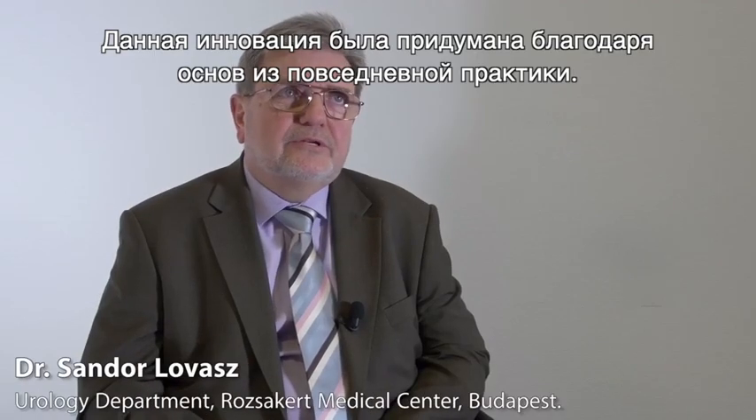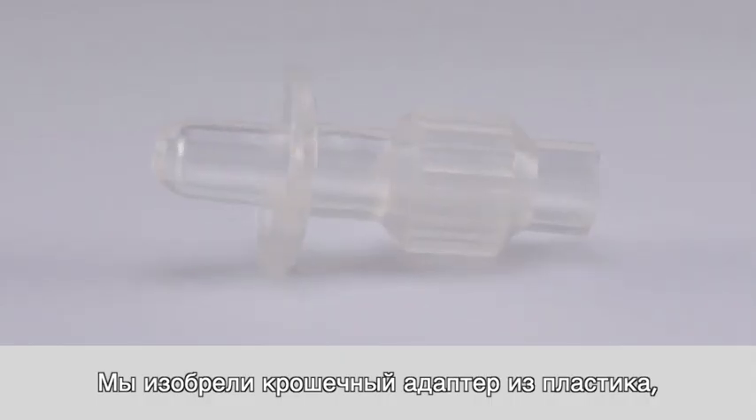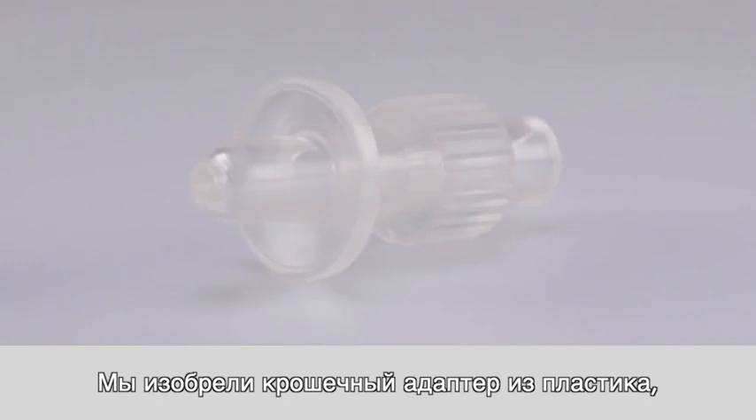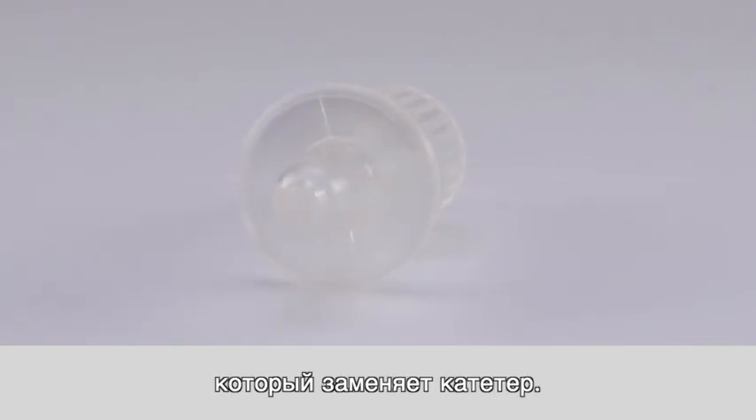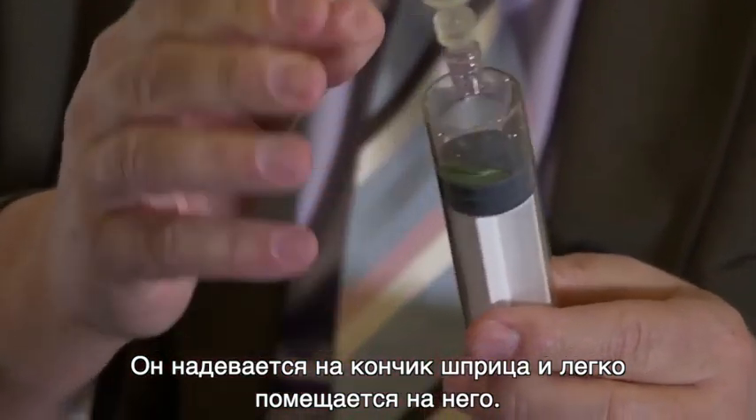One of the innovations basically came from everyday practices. We invented a tiny adapter which is made from plastic, and this replaces the catheter. It fits on the tip of the syringe with an easy movement that can be put on it.